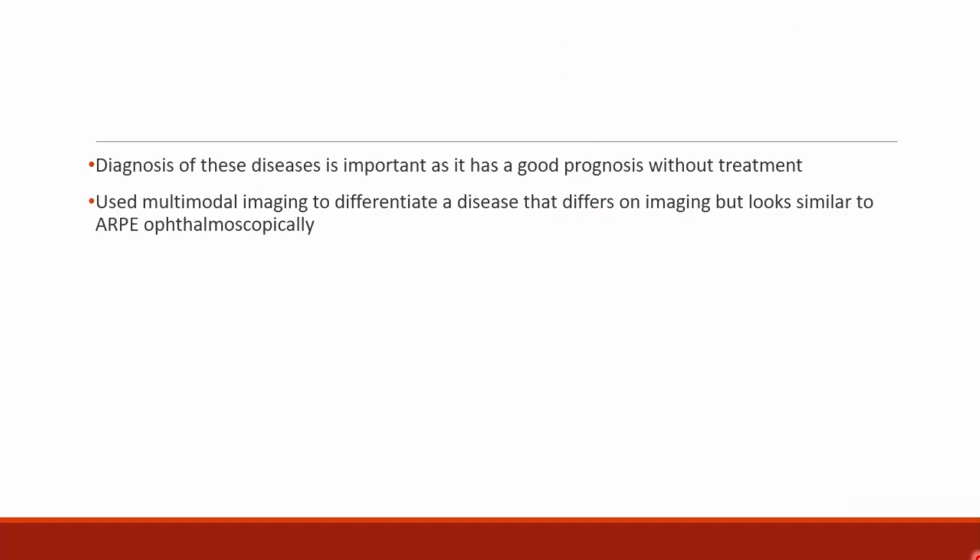So diagnosis of these diseases is important as it has a good prognosis without any treatment. And multimodal imaging helps to differentiate the diseases which can look similar on indirect ophthalmoscopy. Thank you, Aarzoo, for the well-documented cases.